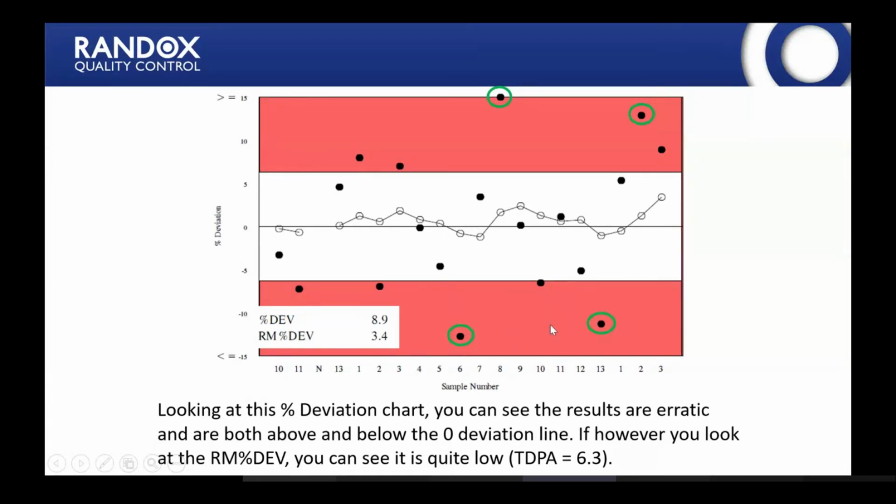are circled in green. So Stephen mentioned the red section is based on the percentage or the TDPA for the sample, in this instance at 6.3, and here you can see the line is sitting here at 6.3. So this is the lab's percentage deviation for the current sample is 8.9, which you can see is in the red zone, but the running mean is 3.4, which is much lower and is within the acceptable limits. But actually, when you look at the overall performance, it's not as good as the running mean might indicate.